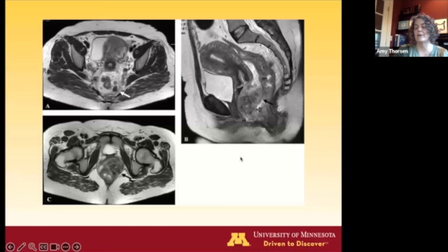You can see the lymph nodes very easily, and these pictures really can't be beat in terms of looking at this disease process with the multi-planar, multi-dimensional views.